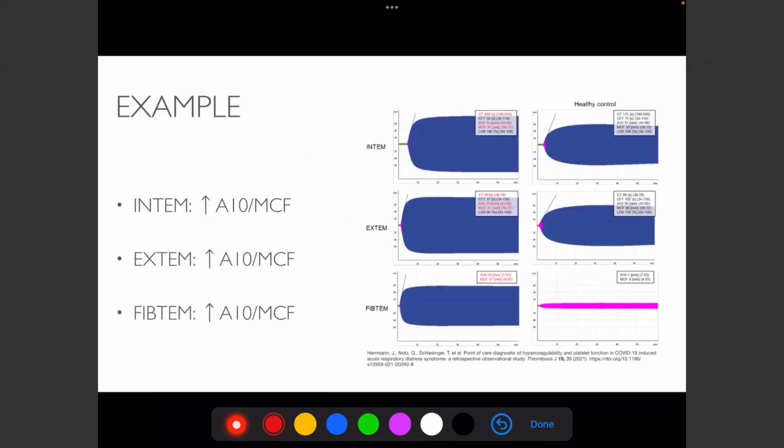Okay, so another example. This is from Daniel. Daniel, going back to the heparin toxicity in post-cardiac surgery patients, what is the incidence like? Is that very rare where they still have too much heparin on board after protamine reversal? I think it's rare because, especially reading on the protamine stuff, it looks like most protocols give a big dose of protamine and it's too much.